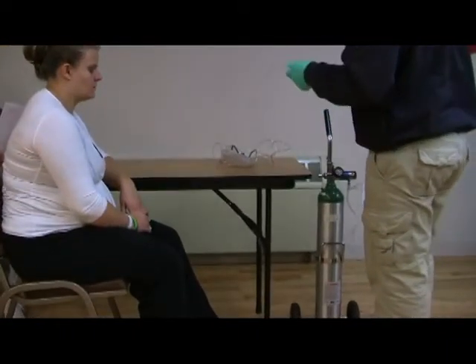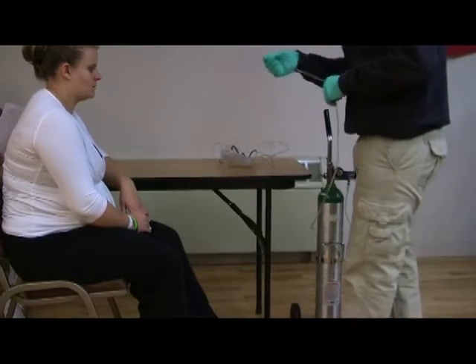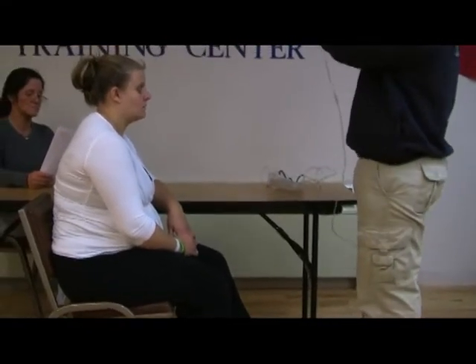I'm going to set my flow rate to 6 liters per minute. I'm going to place the device on my patient.